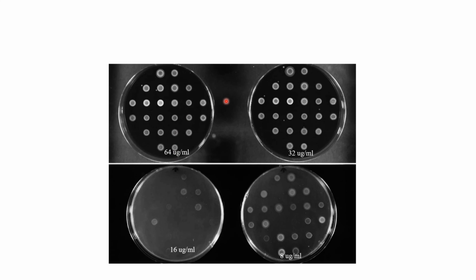And after the incubation, we will get the observation like this depending upon the organism and the concentration of antibiotic we used. So by seeing this growth in each plate, we can interpret the MIC, that is minimum inhibitory concentration of antibiotics for bacteria.